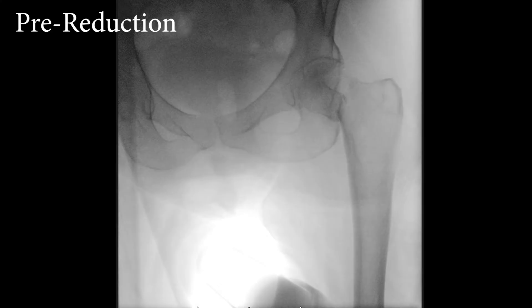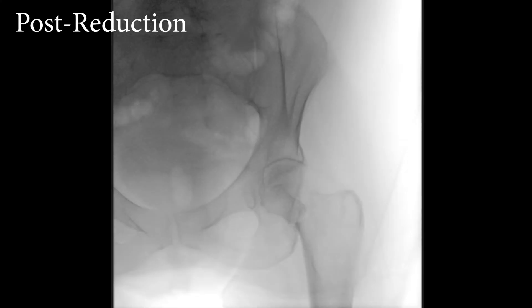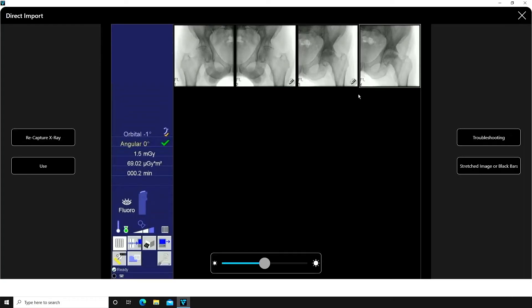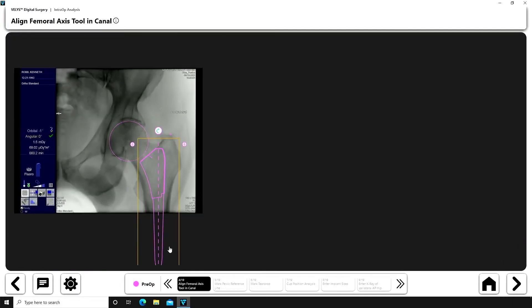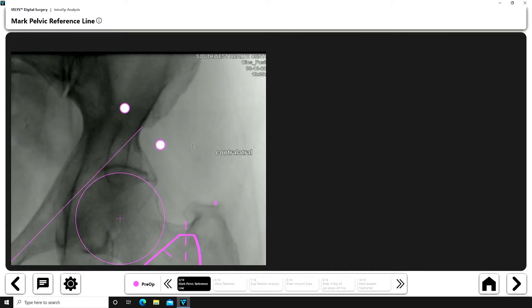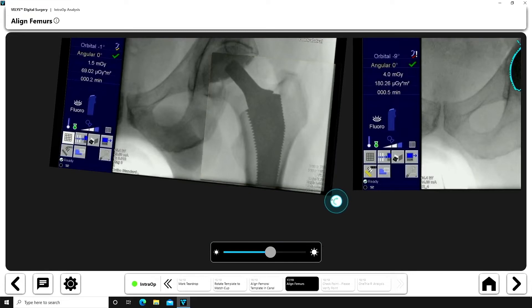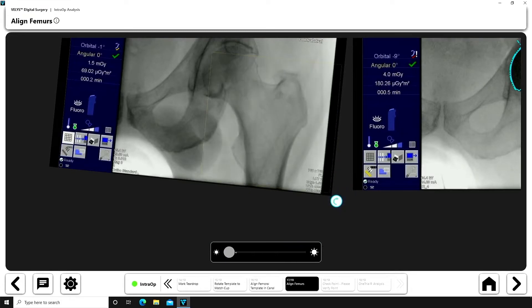The traction method is a technique I frequently use for femoral neck fractures, reducing the hip anatomically at the beginning of surgery and using these images as a reference for the one trial analysis. The beauty of all these methods is that these images can be obtained prior to starting surgery. The reference points are then marked by the sales consultant while the surgeon is operating. With the trial implants in place, the images are then used in the one trial analysis.